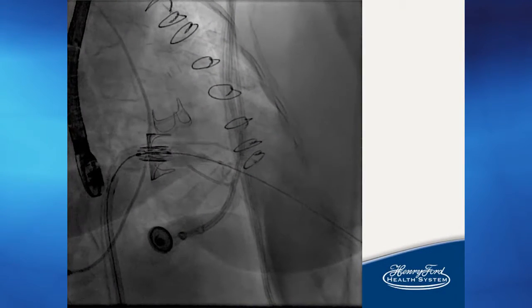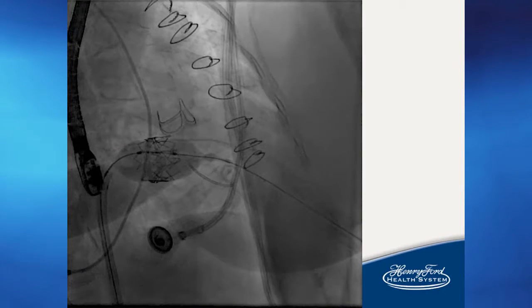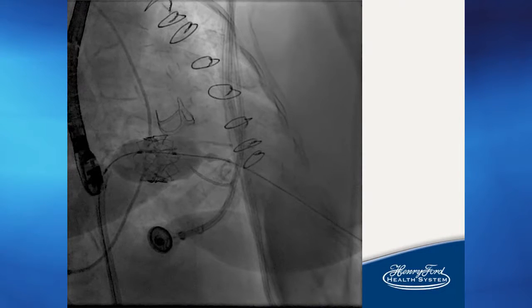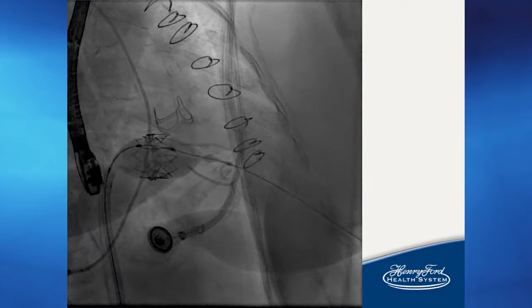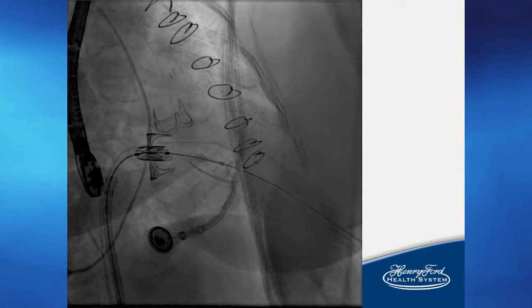And here we're implanting a valve. This is a stenotic, failed bioprosthetic valve. And again, with the same process that we did before, we inspected and examined the left ventricular outflow tract and understood what our risk for obstruction was.